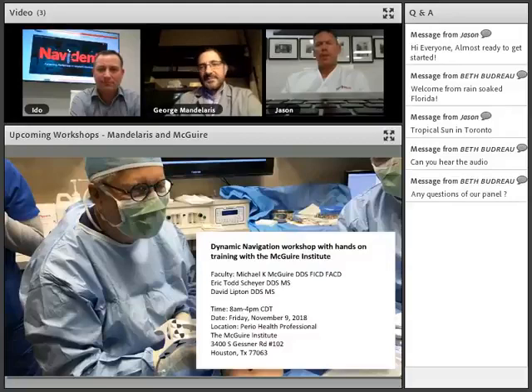Regarding the head tracker, of course, as with all of this, we're in a beta phase. George alluded to the fact that we go with 3 points to trace, and then back for 2 points, 4 points to trace. Just for your information, the latest update, which you now have, we're back to 3. So you can do 3, and that's up to you.